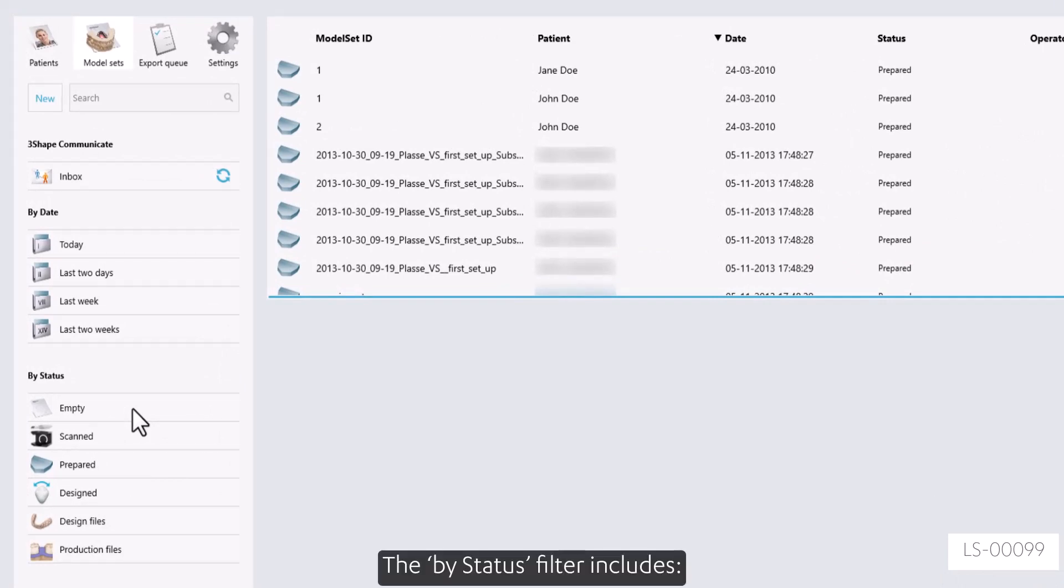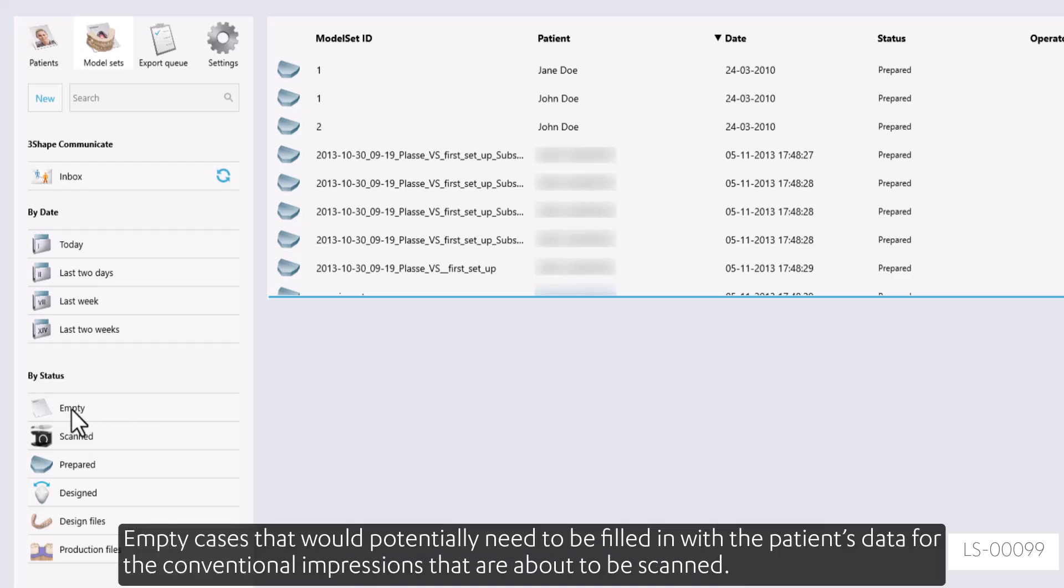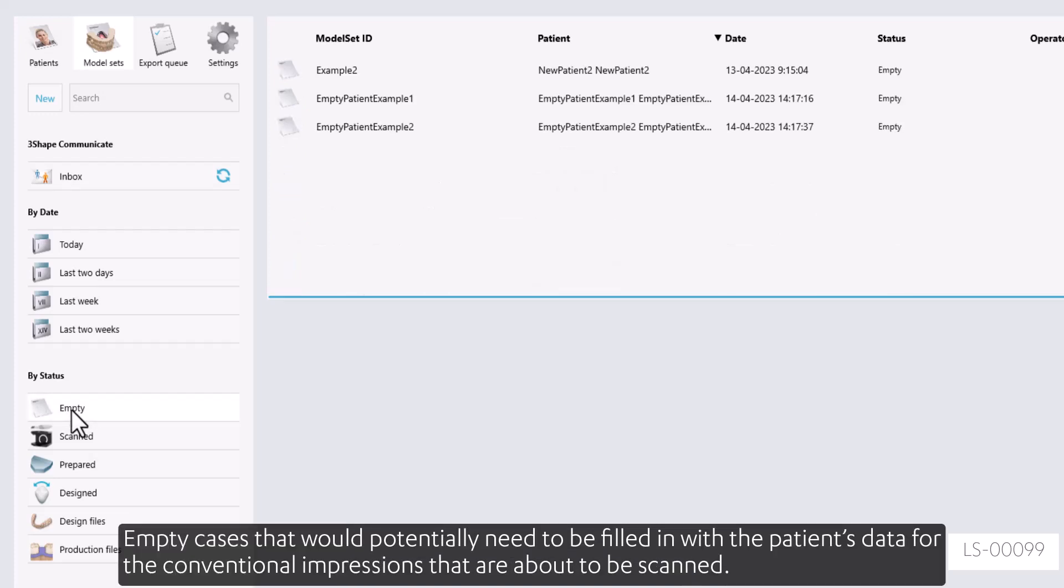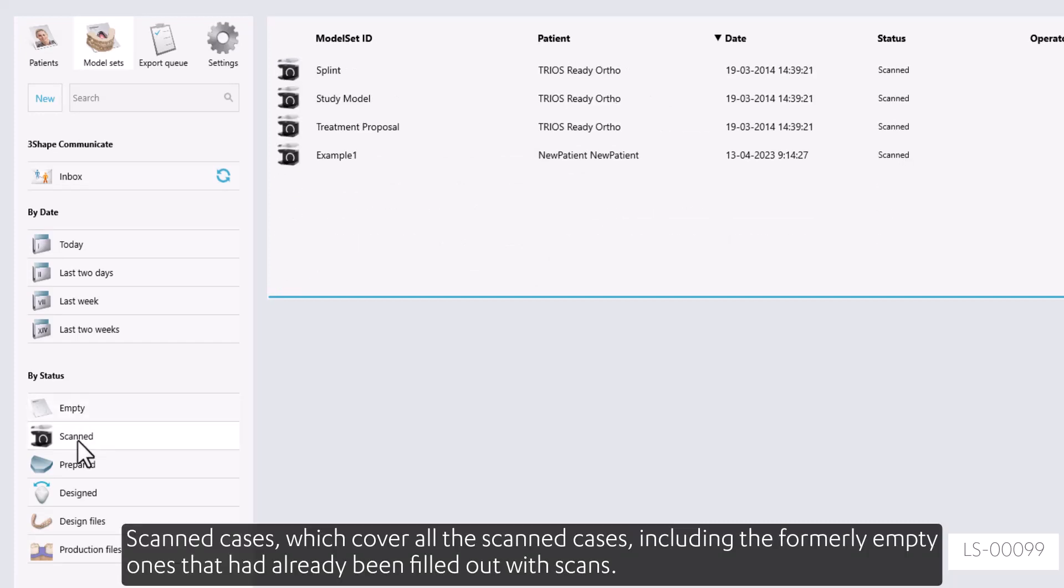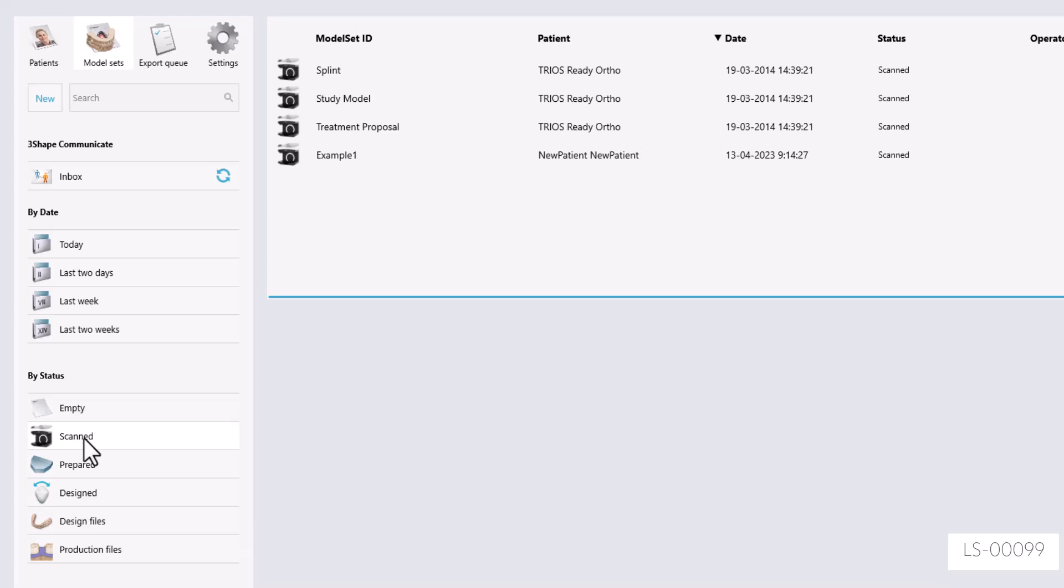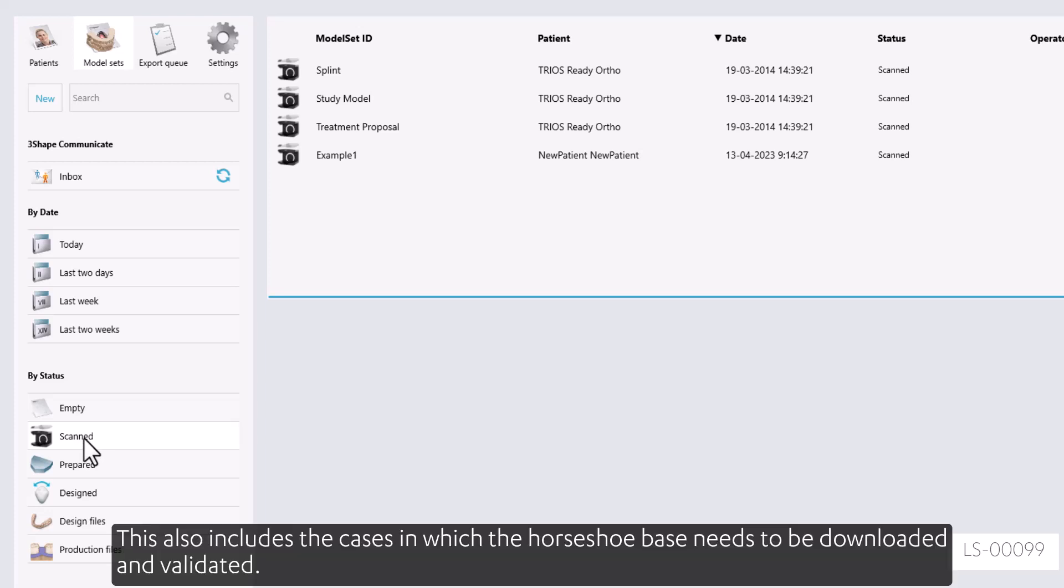The By Status filter includes empty cases that would potentially need to be filled in with the patient's data for the conventional impressions that are about to be scanned. Scanned cases cover all the scanned cases including the formerly empty ones that had already been filled out with scans. This also includes the cases in which the horseshoe base needs to be downloaded and validated.